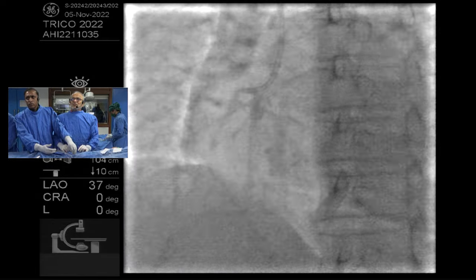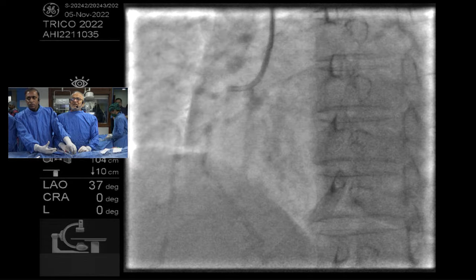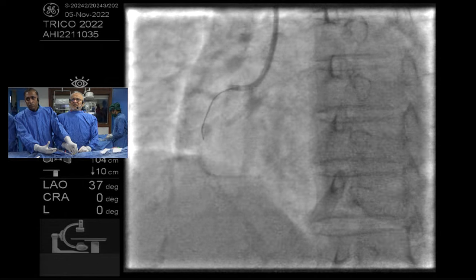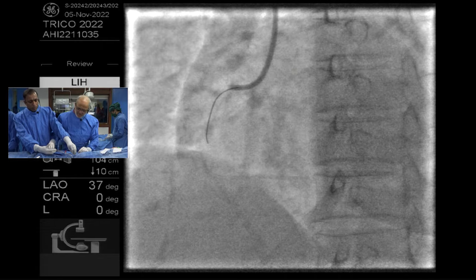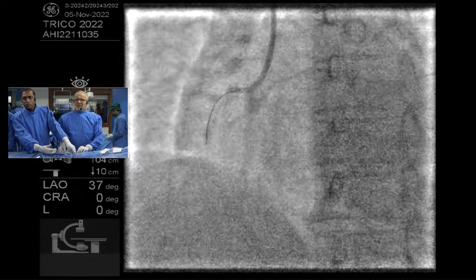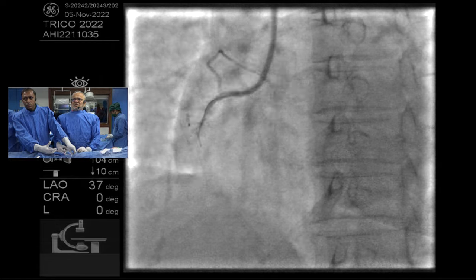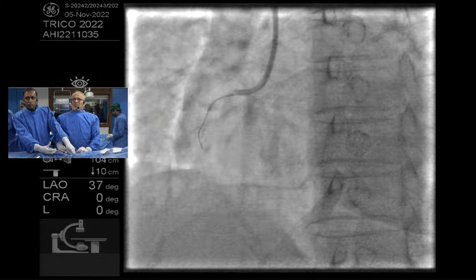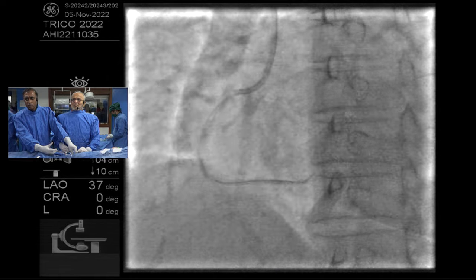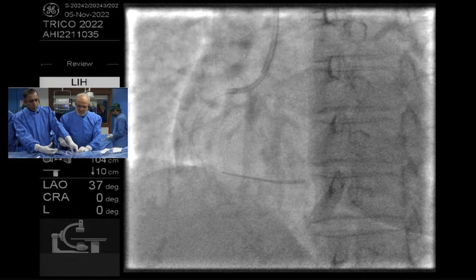This looks like a great and complex case. Just tell us briefly — how old is that RCA stent? April 2022, not very old. And what was the size of that stent? It was done outside, we don't know — the patient has come from a rural area. On the baseline angiogram there was a very critically tight lesion.